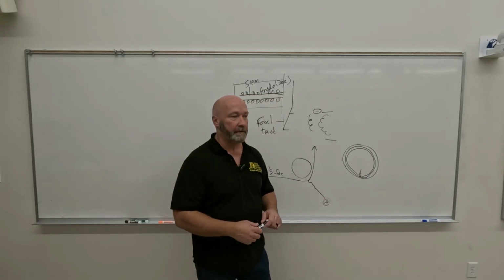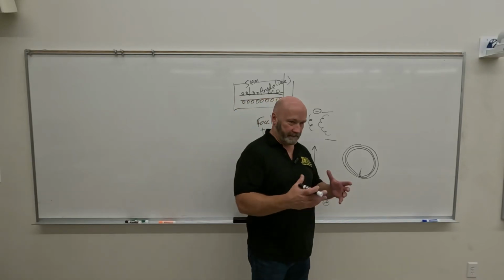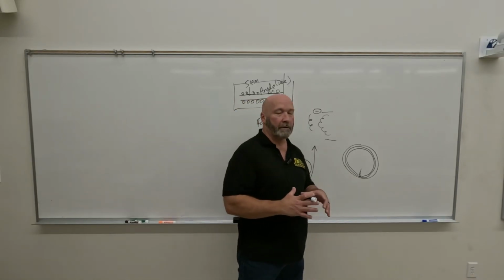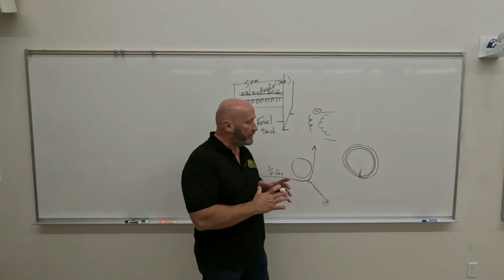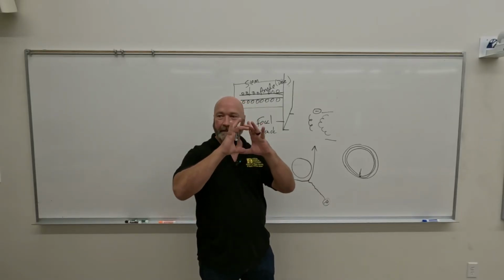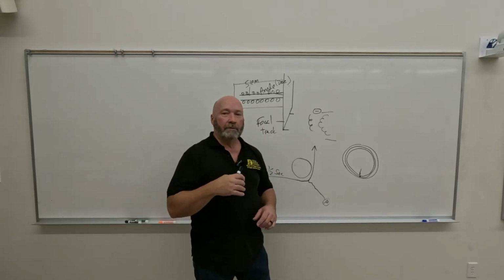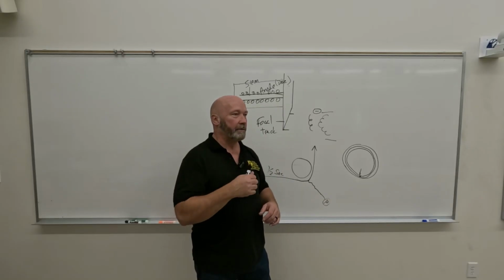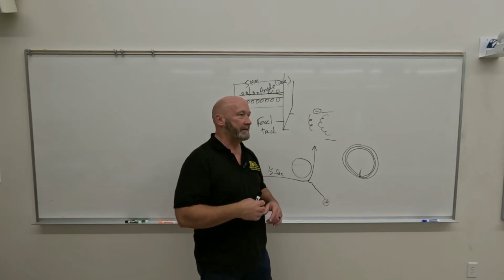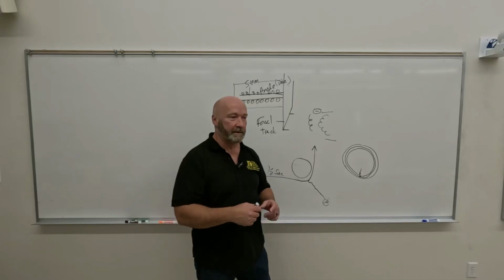and spread out the heat more efficiently. Okay, so most of your tubes are going to follow what Bushong said, about 3,400 RPM, and your disc size is going to be about the size of the disc that I passed around on Friday. Okay, so is there a way that you could further increase the heat capacity of the X-ray tube just on the anode itself?